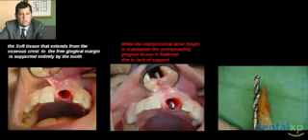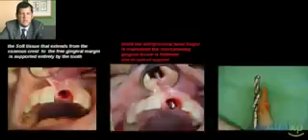We are controlling the buccopalatal position and the mesiodistal position of the implant, and after we extract the tooth, we are controlling the length and we are trying to engage a minimum of 4 mm above the extraction socket for primary stability of this implant, so that we can make immediate loading.